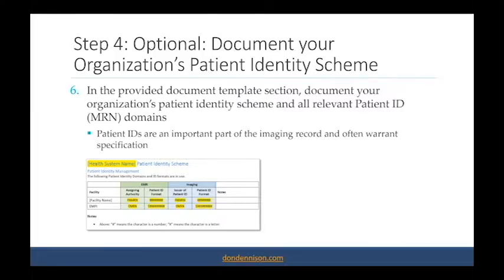So what is the EMR? What is the assigning authority value? What is an example of the patient ID format? Is it 6 characters, 8 characters? Is it prefix, not prefix? And then within imaging, what is that being mapped to, which is not always a one-to-one mapping.